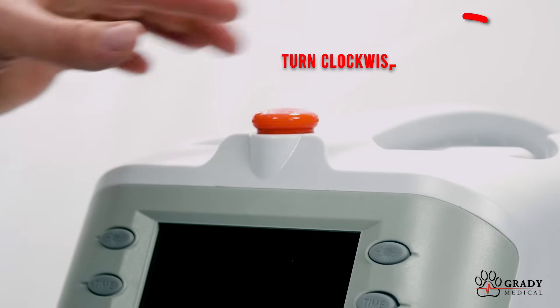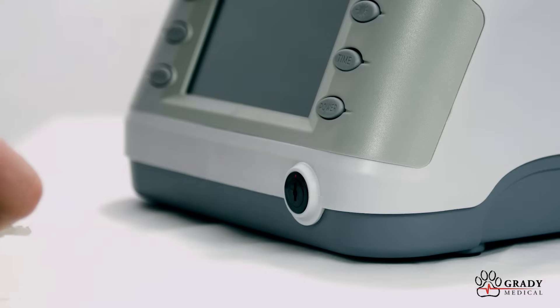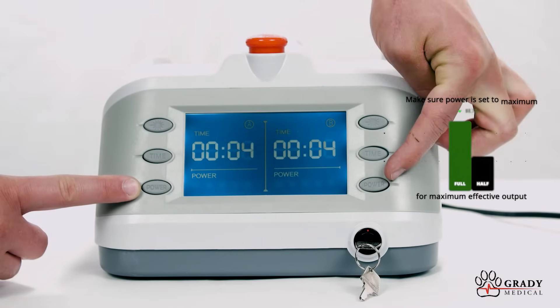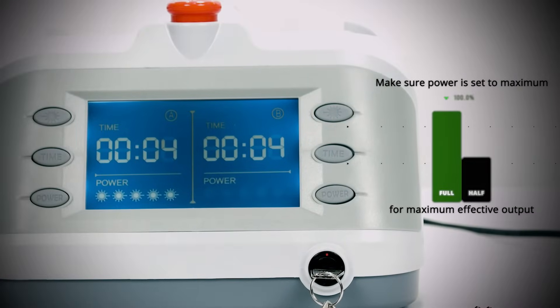The Vet Flash has a safety stop switch that has to be deactivated before you can turn it on. Turn clockwise to turn it off. Insert the key and turn clockwise to turn on the device. The bottom button on either side, labeled 'power,' is a standby button. Press once to deactivate standby mode. It's now ready for a treatment.